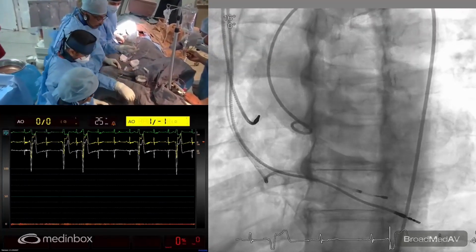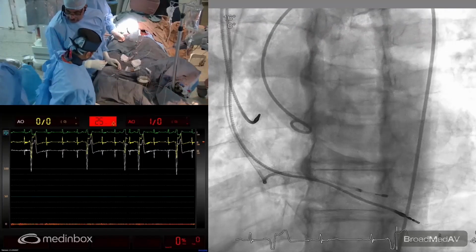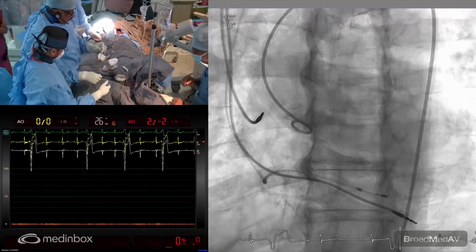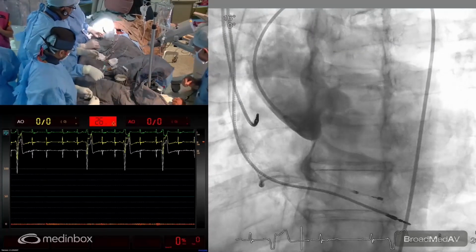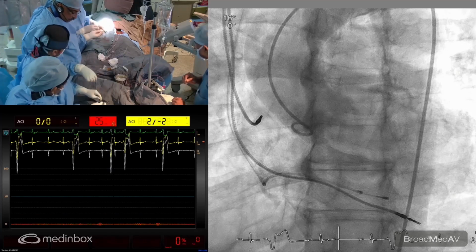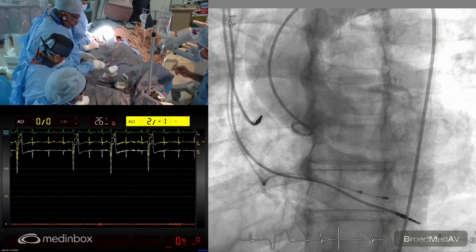Right, just give me a dilator, a plain ascending aorta dilator. The aortic angle from the arch, 9 or 6, anything is okay. So is it going to be at 3 o'clock or 2 o'clock, was the discussion between us in the commissural alignment. Then finally we thought that we will go for a 2 o'clock commissural position. Let's see how it gets aligned at 1 month.